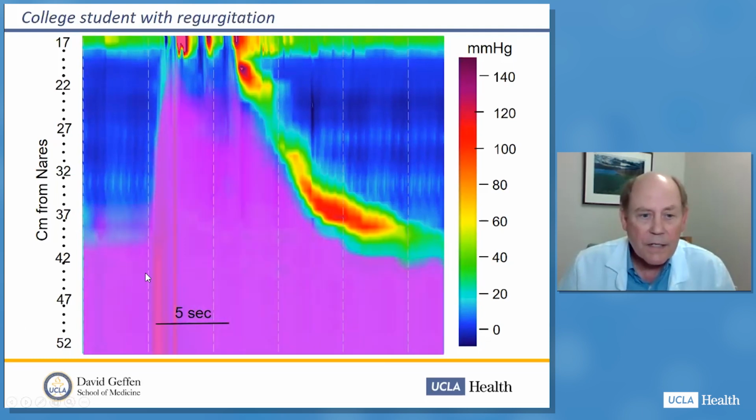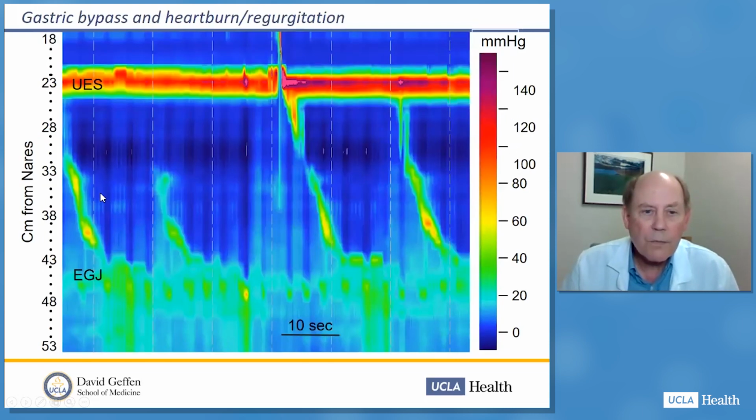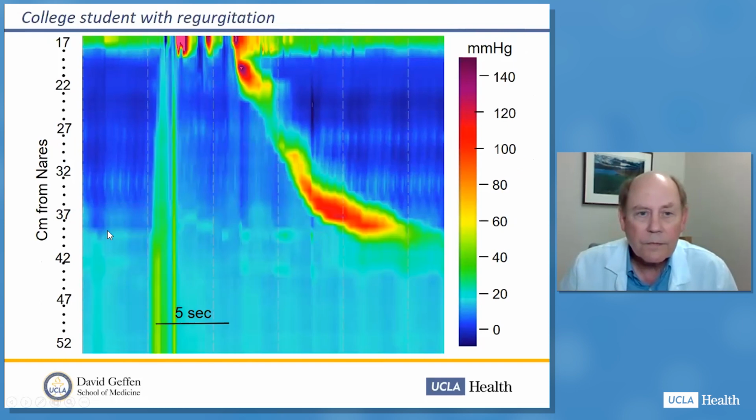It shows that a bolus is moving from the stomach up into the esophagus. And then with a peristaltic wave, it's pushed back down into the stomach. So this is what we see when we have a patient with rumination syndrome.